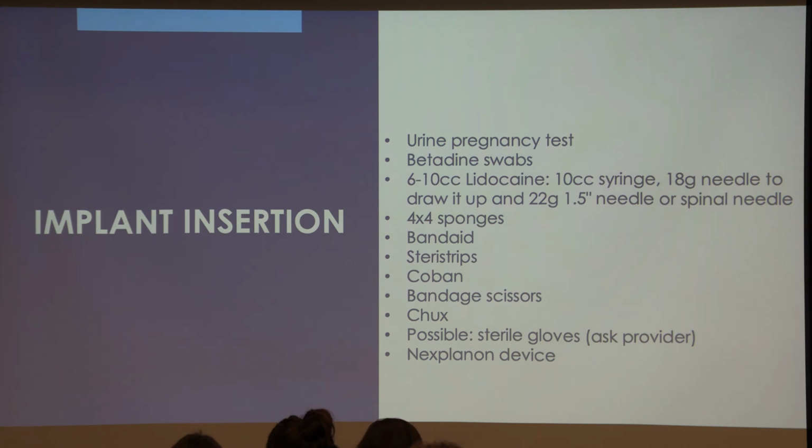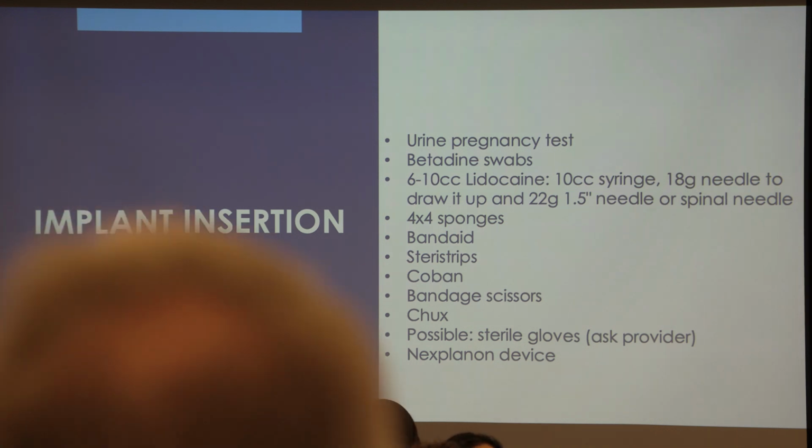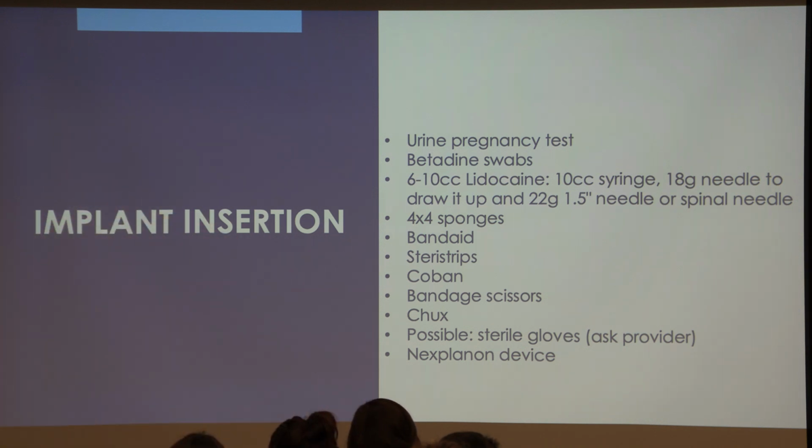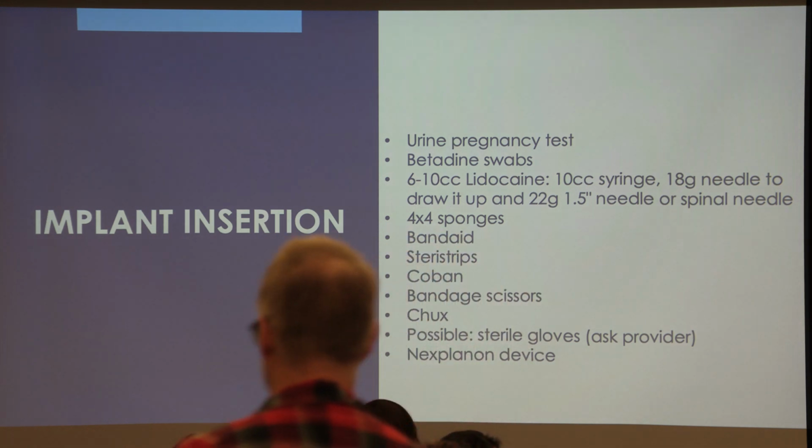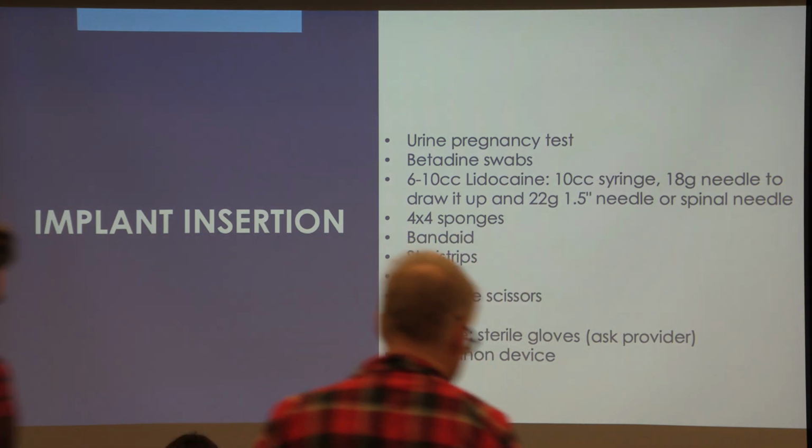We do need betadine. Again, I'm sorry, I didn't note if they have an intolerance to betadine, shellfish. There are alternatives. Hibiclens is one. Lidocaine is needed. Our 10 cc syringe, our 18 gauge needle to draw up.